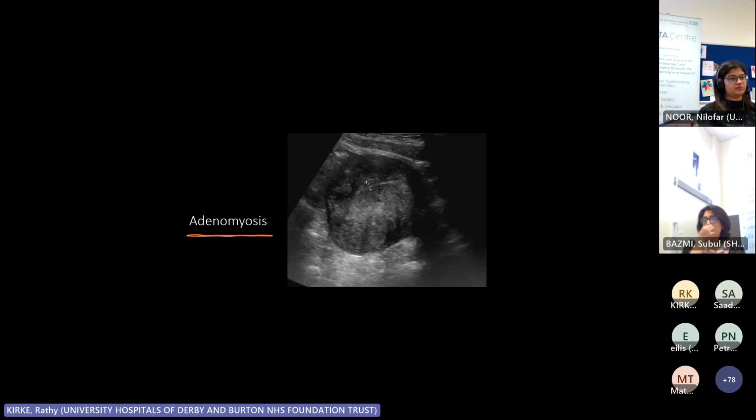Now, the other thing that's associated with the spectrum of endometriosis is adenomyosis. So you've got a fairly asymmetric myometrium on either side of the endometrial stripe. You've got a very, very thickened posterior junctional zone. People talk about a classical Venetian blind-like effect when you get lots of shadowing in the posterior part of wherever the adenomyosis is. Sometimes you can just see nice, bright echogenic glands.